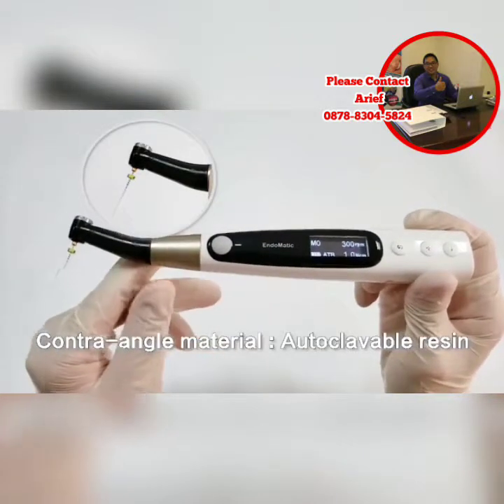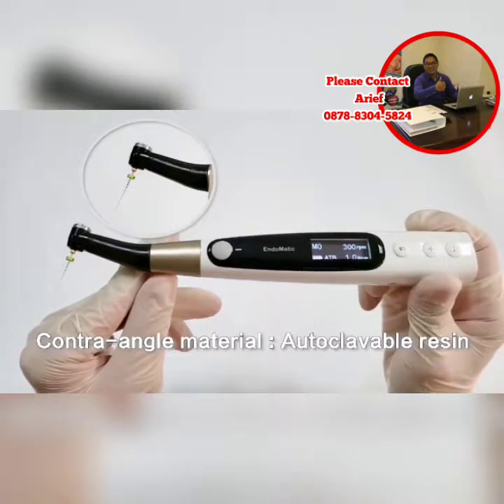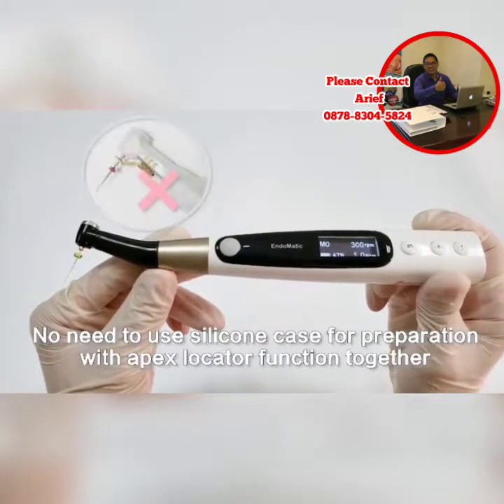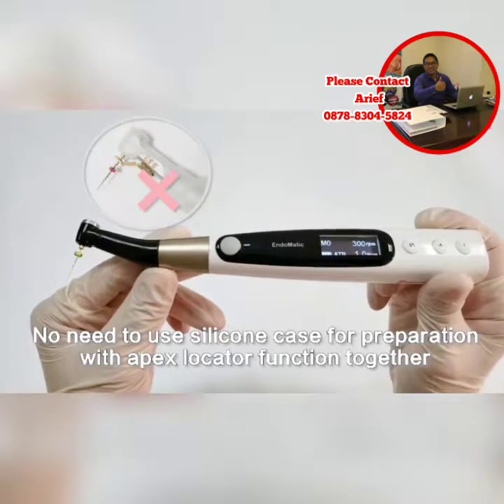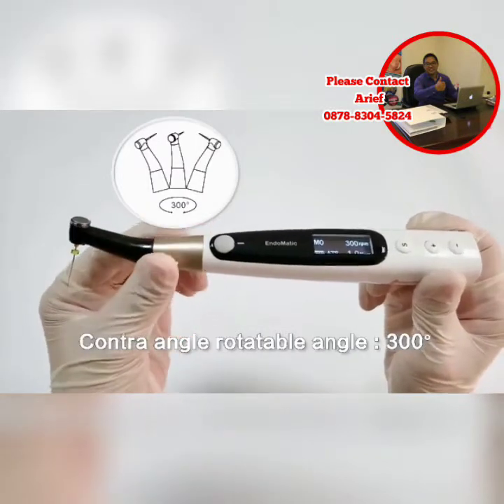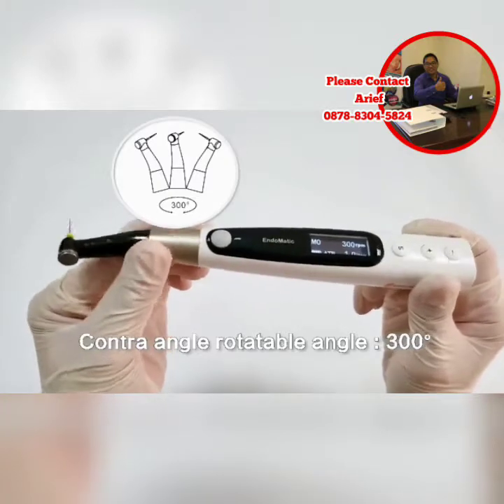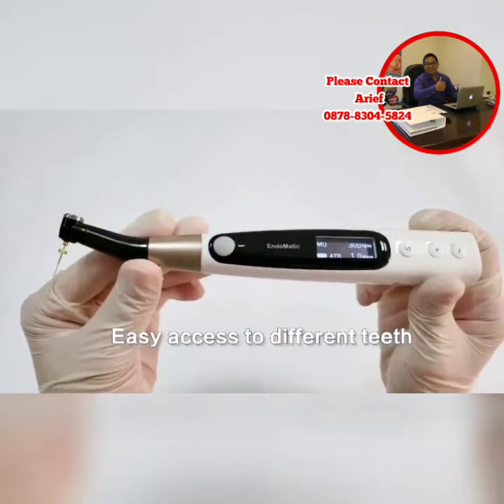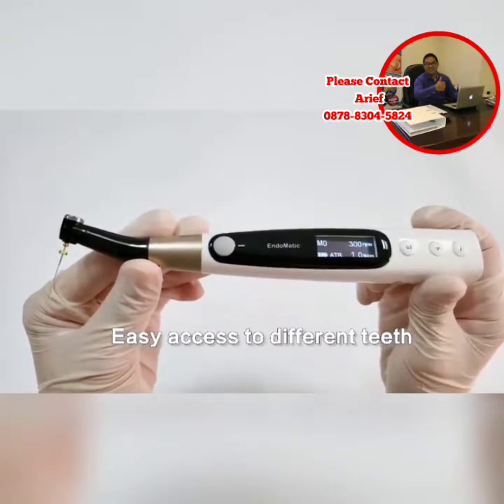Let's look at its contra-angle. It's made of autoclave resin. So for preparation with apex locator function together, there's no need to put on a silicone case. This contra-angle is 300-degree rotatable, so it's quite convenient for different access preparation.